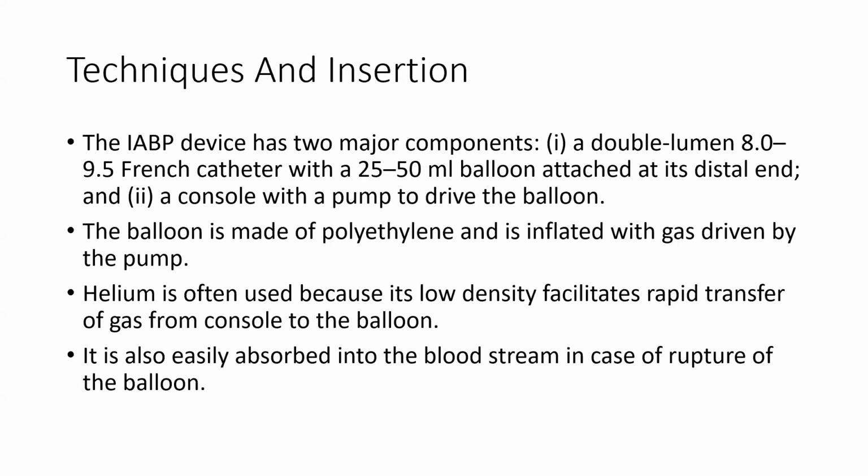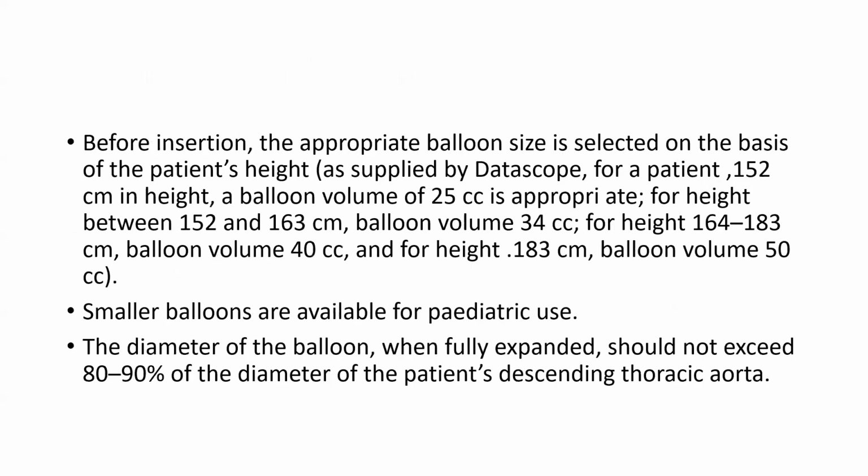driven by the pump. Helium is often used because its low density facilitates the rapid transfer of gas from the console to the balloon. It is also easily absorbed into the bloodstream in case of rupture of the balloon.